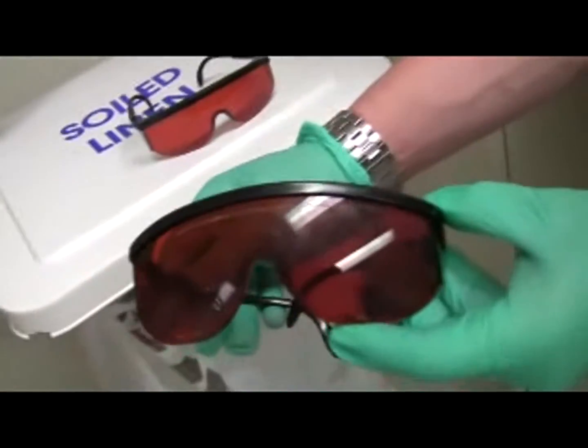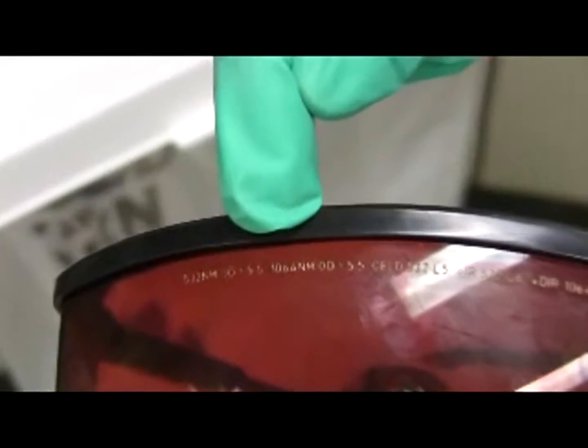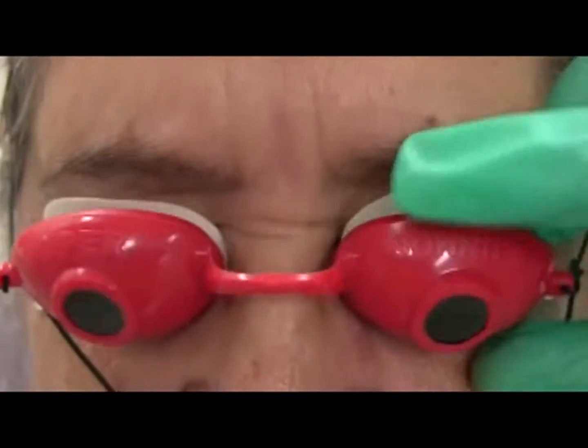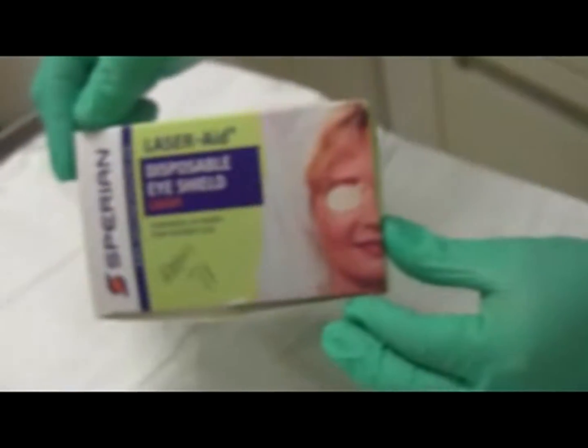We have these goggles — the wavelengths in this case are 1064 and 532, those are the wavelengths of the Q-switch ND YAG, so these are the appropriate goggles. The patient has these eye shields here. They can either wear the glasses or wear these disposable laser eye shields.